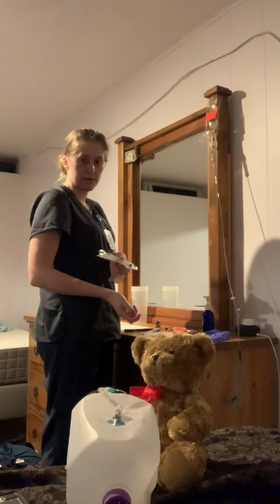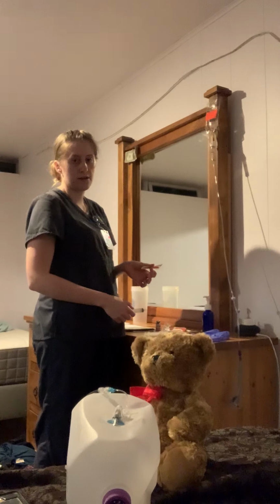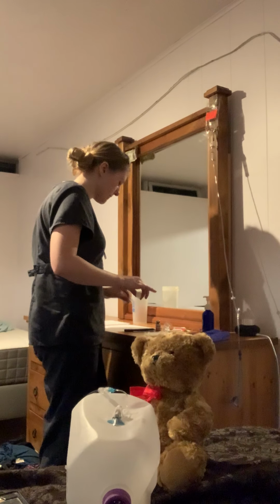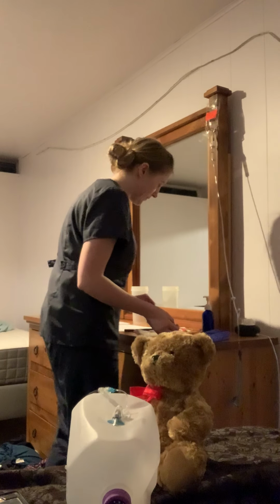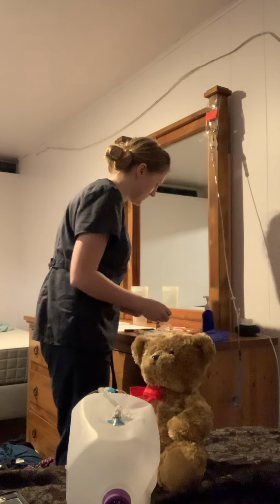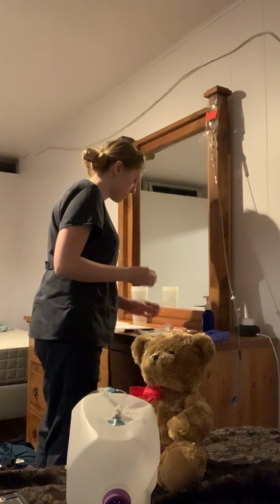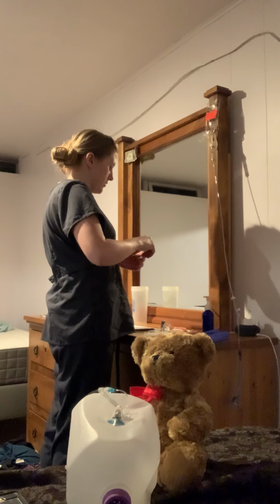So I've got my syringe here. And I'm going to be using a blunt filter needle because I'm drawing it up from the vial. So again, sterile technique, twisting it on. And I'm going to alcohol swab the vial, 15 seconds in circular motion. Let that dry. Now I am going to take the needle off.